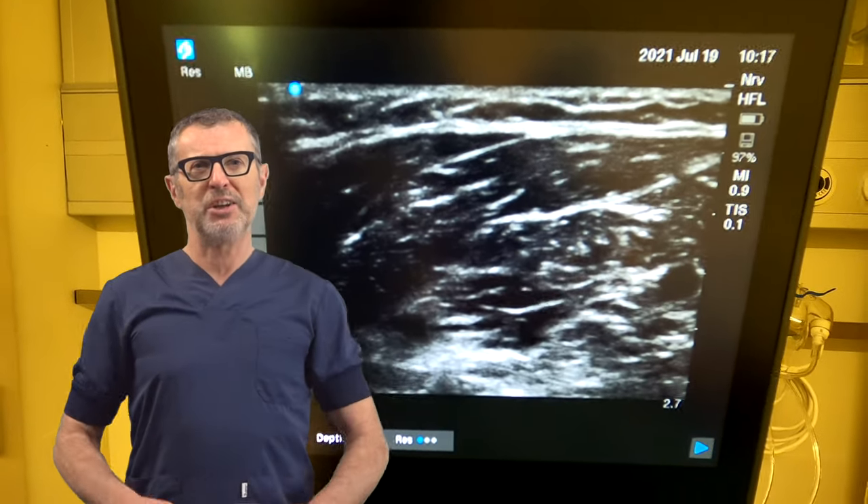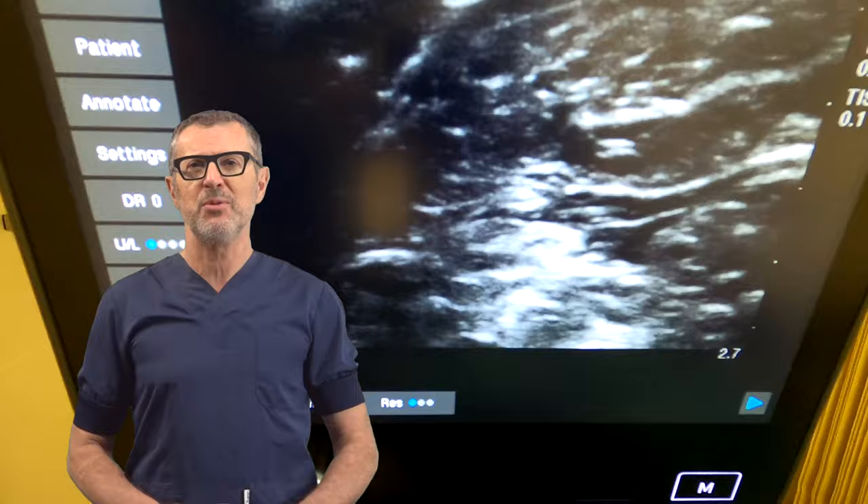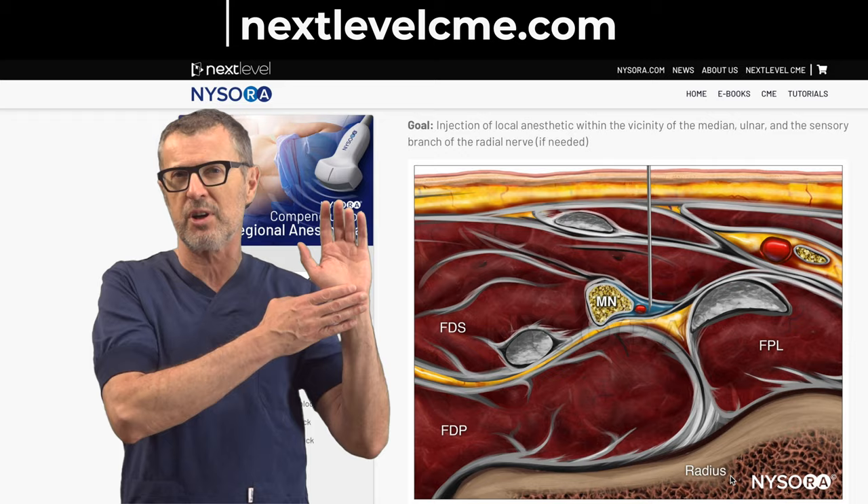In this video, I will explain our anesthesia method for carpal tunnel syndrome surgery. I will walk you through the procedure on an actual consenting patient and then we will review the nuts and bolts about the wrist block technique that are customized for carpal tunnel surgery and a fast turnover.